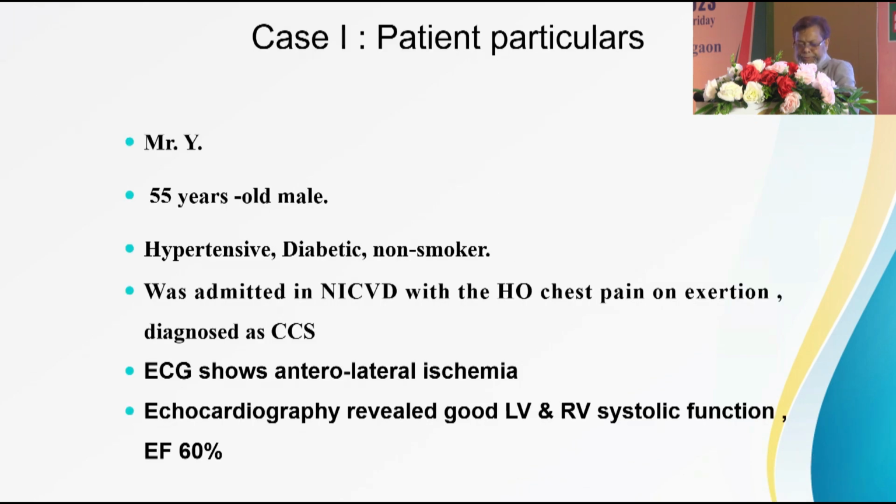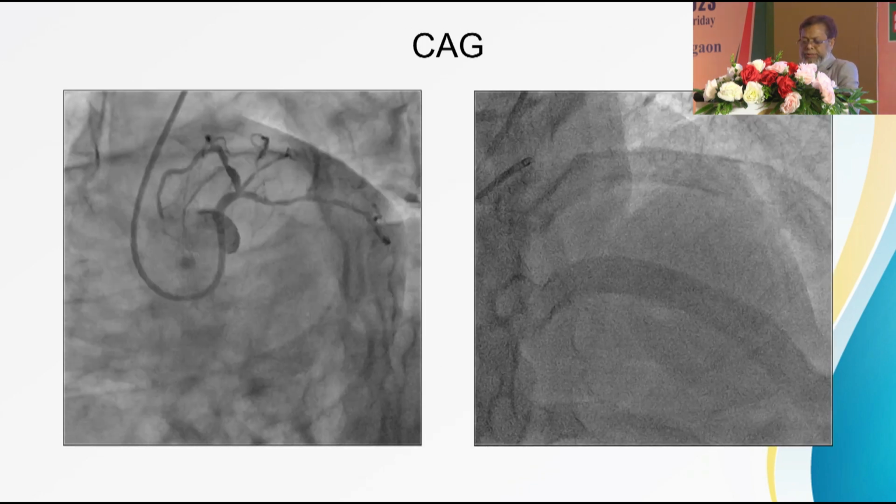This is a patient, 55 years old, hypertensive, diabetic, non-smoker, with a history of chest pain on exertion, admitted to our institute, and we did the angiogram.